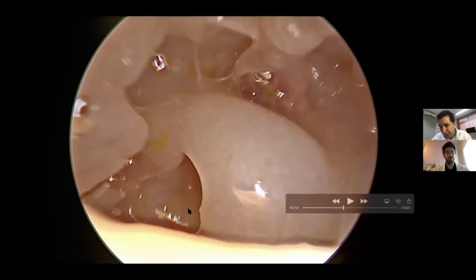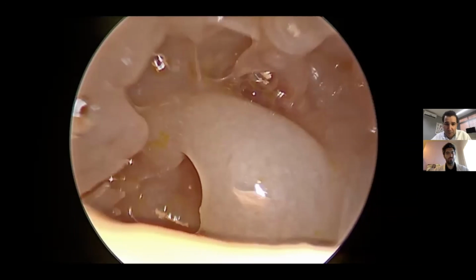In this specimen, it's not present. We don't have the CT scan of this head, but probably if we did the CT scan, we would see that the petrous apex would not be pneumatized, would not have air inside. So we can see here. Another question is, where's the posterior sinus, or why is it called the posterior sinus? Because it's very important, and it's very important to know the history.